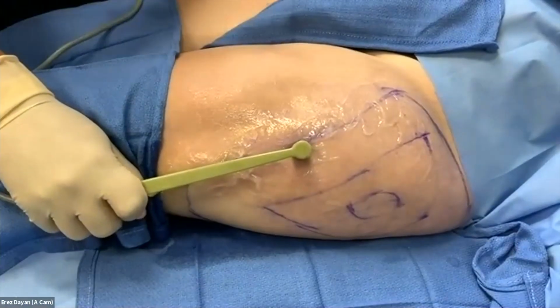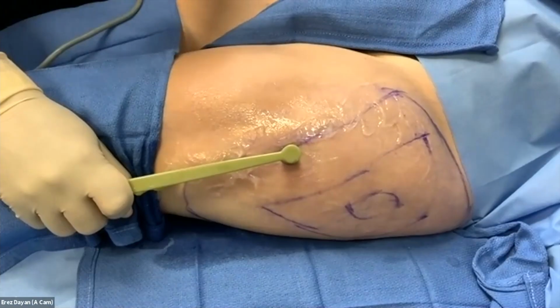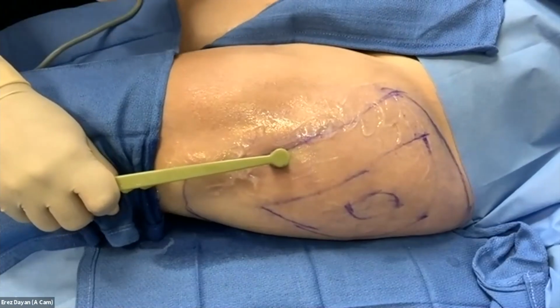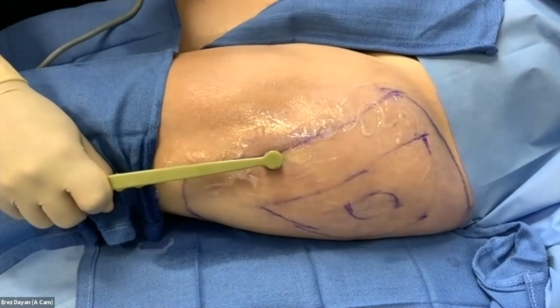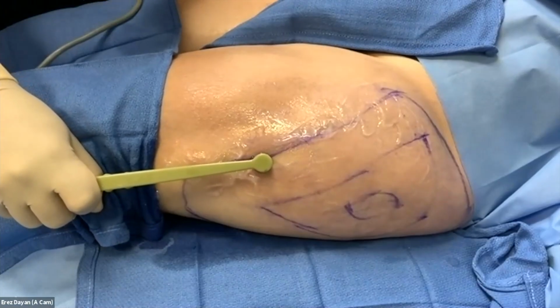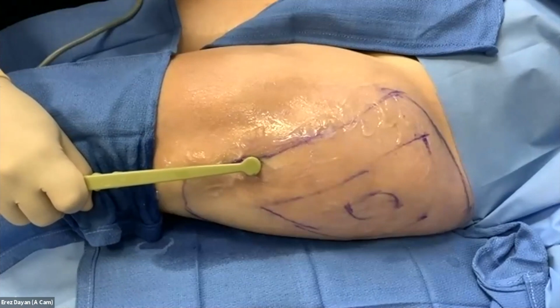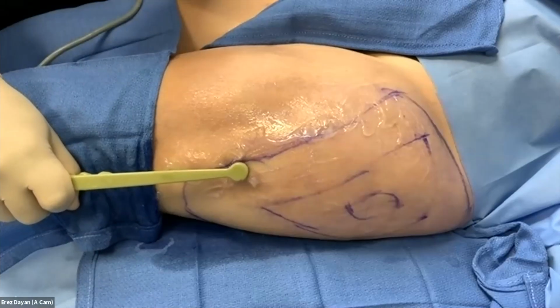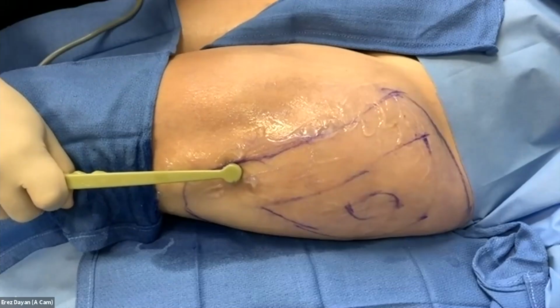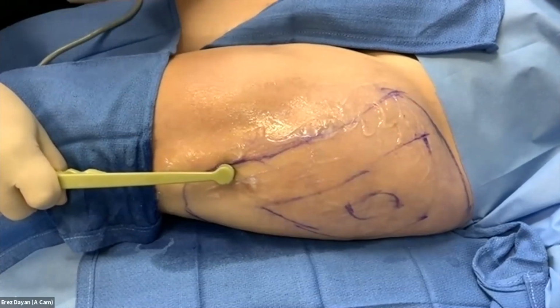So here, that's a slow beep. The double beep means I'm approaching target temperature. So I'm moving pretty slowly, staying in the same row. And you guys probably can't hear this, but there's some crackling. I can hear it from here, which is kind of a gratifying sound. So you see the temperature is approaching more closely.